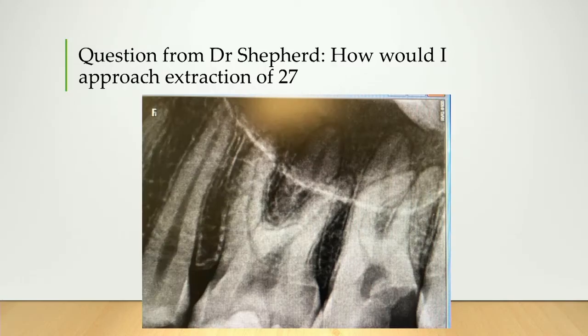Okay, good. Dr. Shepherd, everyone's interested in your case, which is great. So what happens if there is a fractured root and the patient has symptoms from, say, a bleeding nose and so forth? I rarely see the bleeding nose, to be honest. Most of the time, if you cause an OAC, you can see an OAC. It's pretty obvious because you can see the soft tissue underlying.